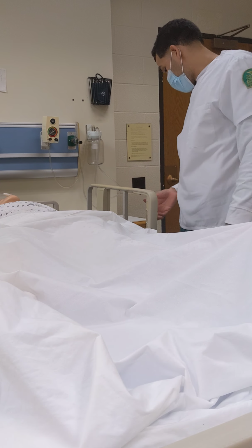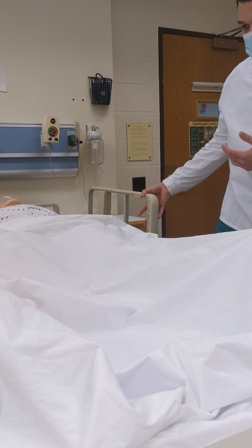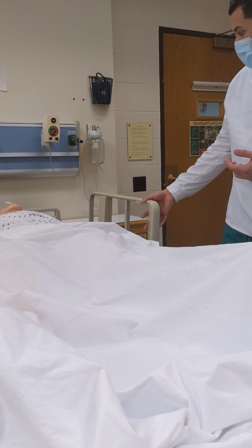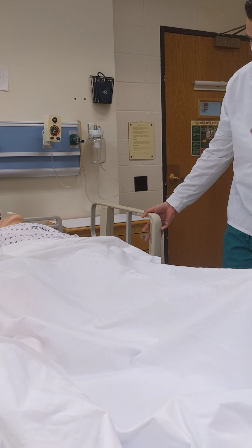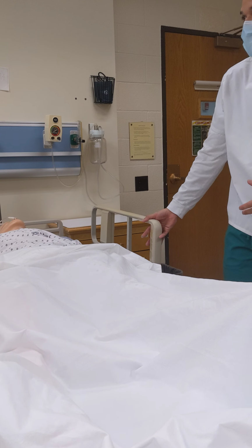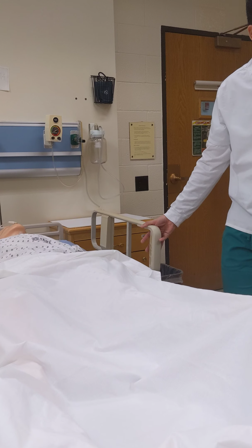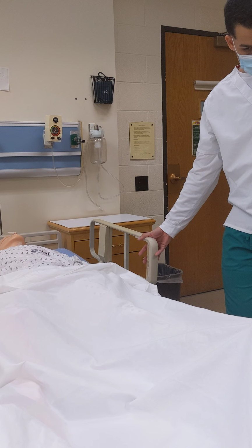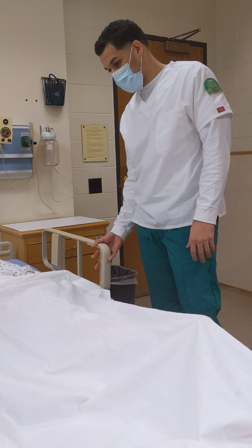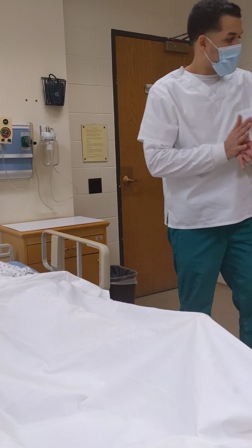Giving the patient their call bell, lowering the bed back to a safe position, asking the client if they have any concerns, questions, or any other needs before leaving the room. Hand hygiene.